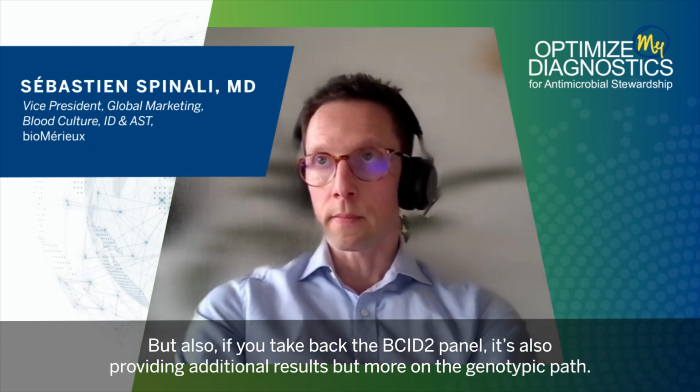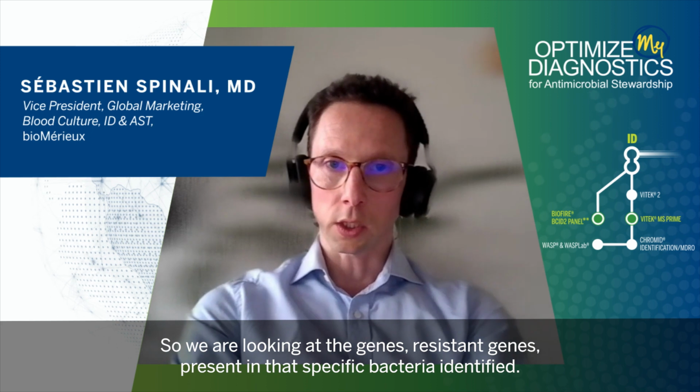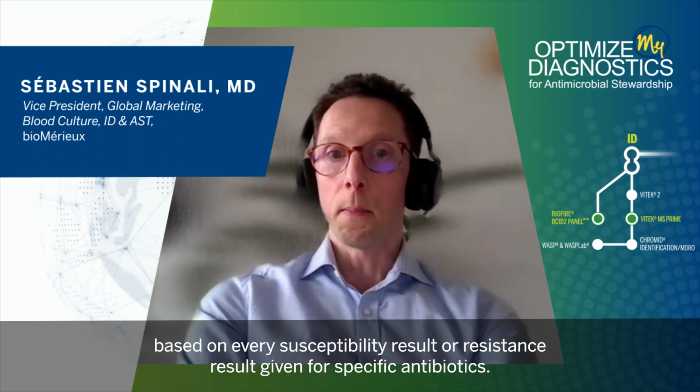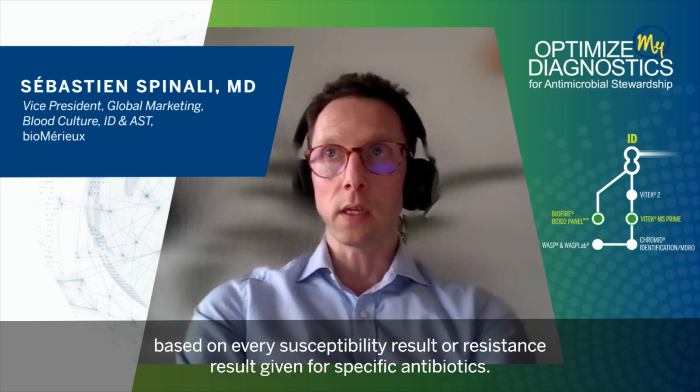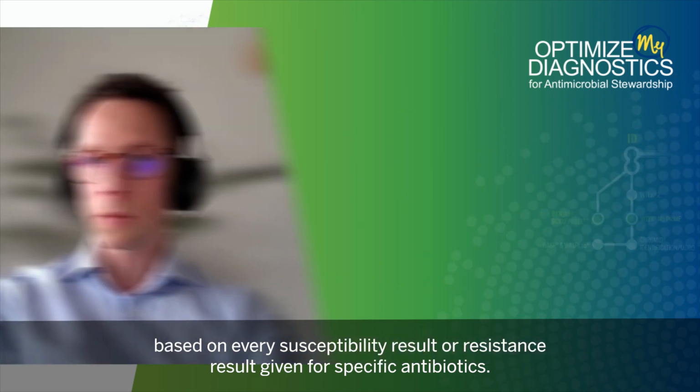But also if we take back the BCID2 panel, it's also providing additional results, but more on the genotypic part. So we are looking at the resistance genes present in that specific bacteria identified, triggering a second layer of stewardship based on every susceptibility result or resistance result given for specific antibiotics.